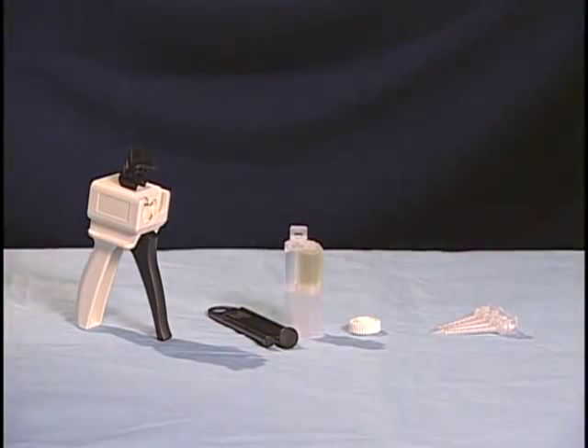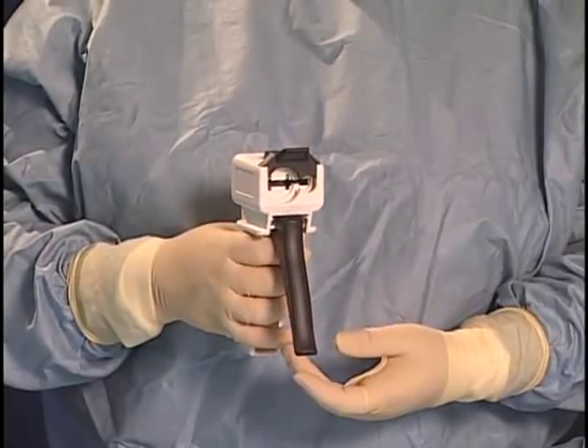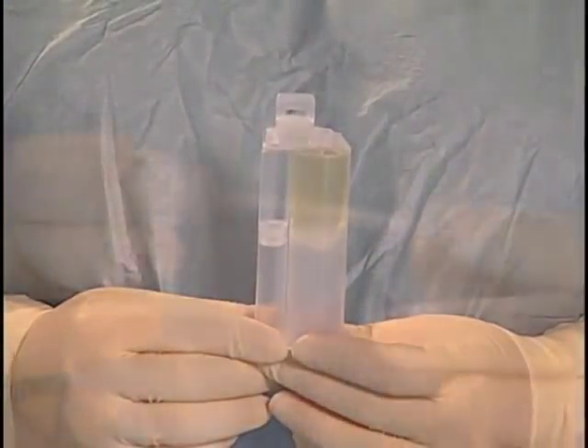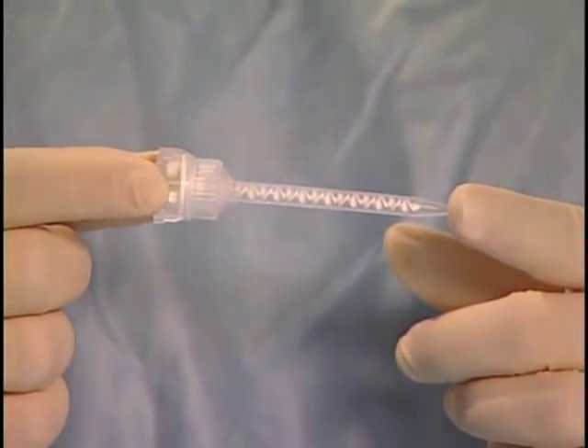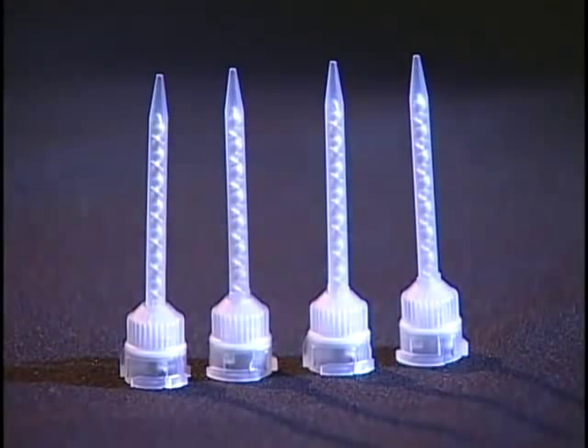Here are the components of the BioGlue Surgical Adhesive Delivery System. All disposable components come double packaged with the contents of the outer package sterile. The reusable delivery device, which is made up of a handle and a plunger, the pre-filled solutions cartridge, the standard applicator tip, and the twist ring tool. There are also applicator tips with flexible extensions. All applicator tips are packaged with 4 tips per pouch and 10 pouches per box.